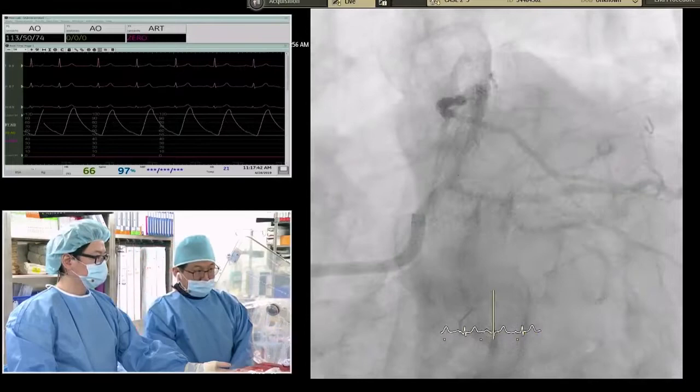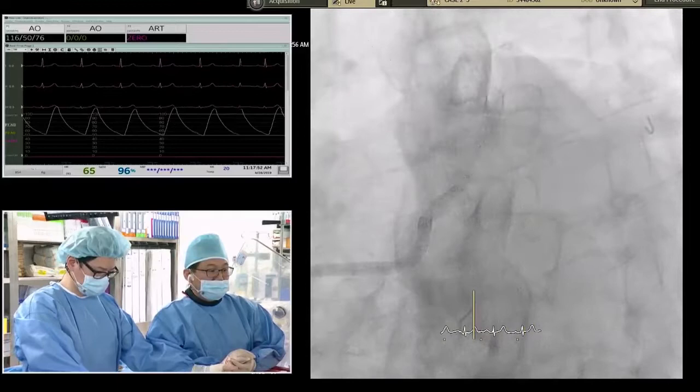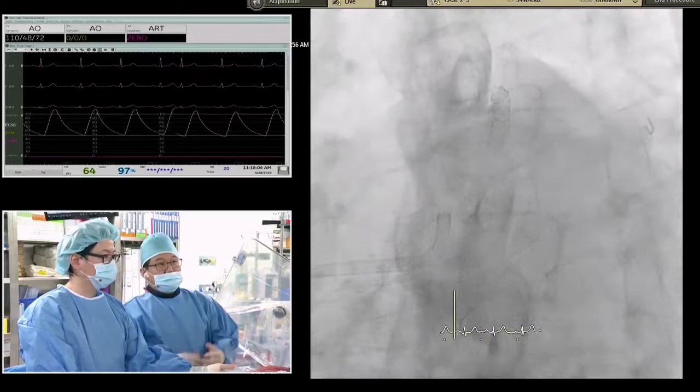Evaluating the ostium of the circumflex by IVUS, I don't trust that. I can see sudden occlusion is easy, the ostium is small, and it's nevertheless a quite large territory, despite the fact that the right is dominant. Yes, I fully agree with your opinion. So we have to think differently.